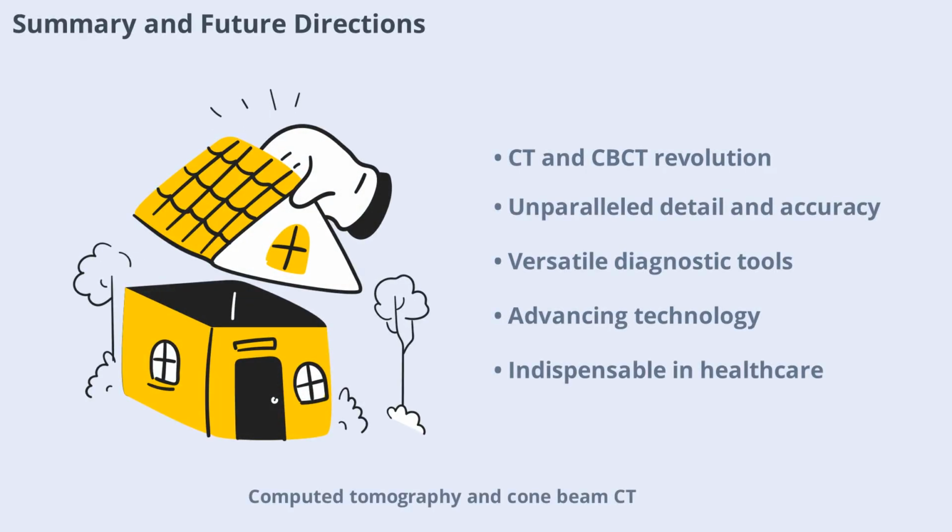Computed tomography and cone beam CT have revolutionized medical and dental imaging, offering unparalleled detail, accuracy, and versatility. From diagnosing trauma and pathology to planning surgeries and implants, these technologies continue to advance, providing clinicians with powerful tools for patient care. As software and hardware evolve, the future promises even greater capabilities, making CT and CBCT indispensable in modern healthcare.